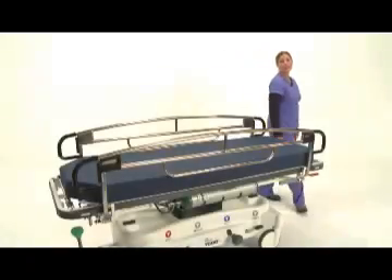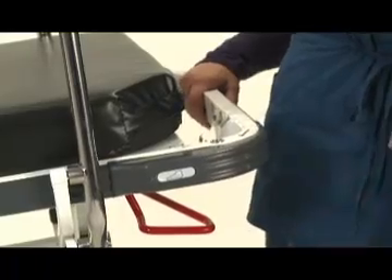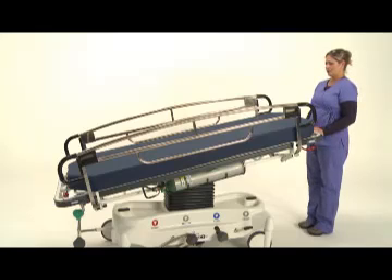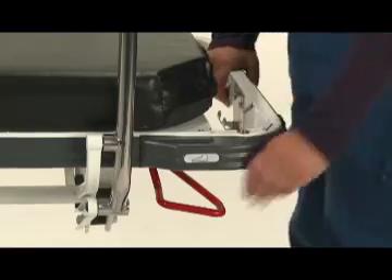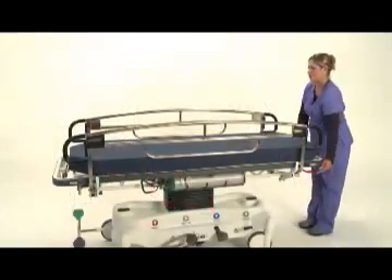Now I'll demonstrate the 7500's Trendelenburg and reverse Trendelenburg function. This is a hand operation on our stretchers. Simply squeeze the red lever and allow the dual pneumatic cylinders to assist in adjusting the degree of trend. To return the litter top to the horizontal position, again squeeze the red lever and push downward until the litter top stops. For reverse Trendelenburg, push the red lever down as well as the litter top at the foot end of the bed to the desired angle.